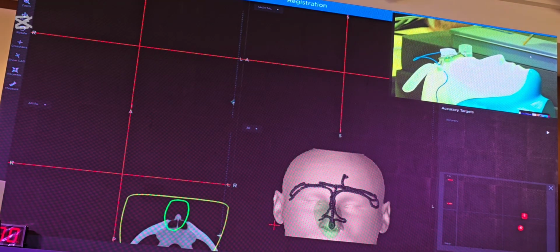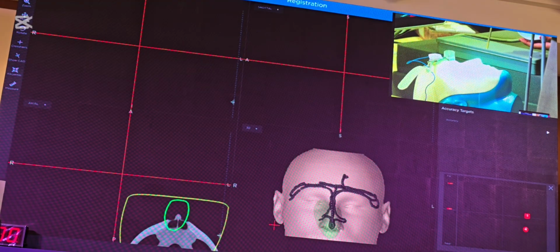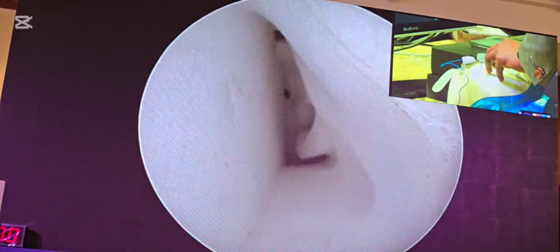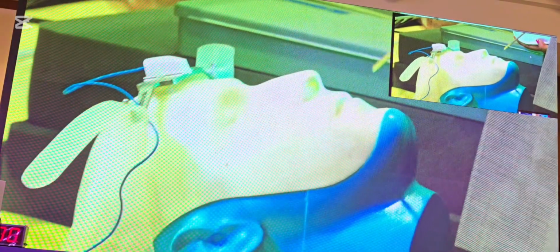This has been connected into this fourth one. So when we are doing surgery, we can have the entire view of the endoscopic image, or in these four views, one window we can use for the endoscope. So that is also possible, so that we can simultaneously see and operate.